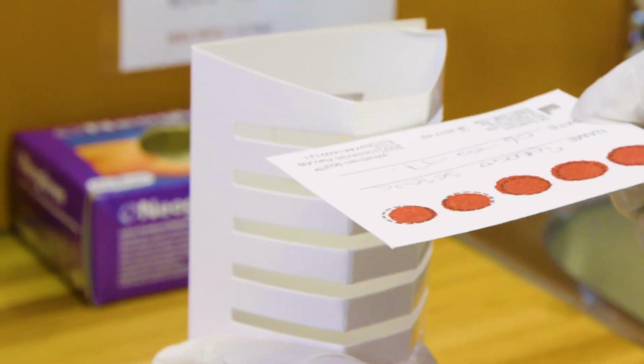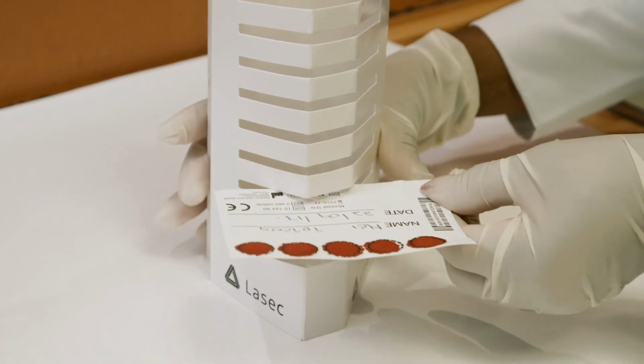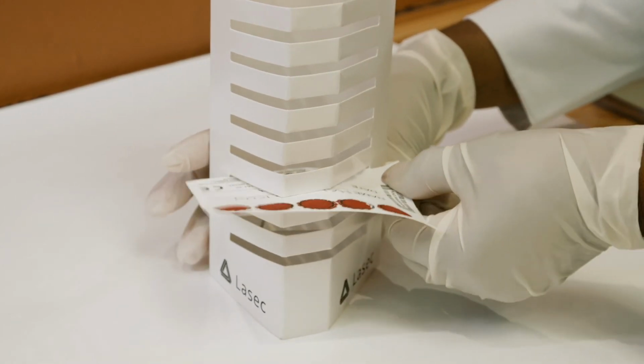After DBS has been collected, it is important to handle them properly so they can be transported to laboratory facilities for accurate testing. After DBS collection, bring the card to the area set aside for drying. The cards should be set in drying racks horizontally so spots are not touching the drying rack or each other and are protected from sunlight, dust, and insects.